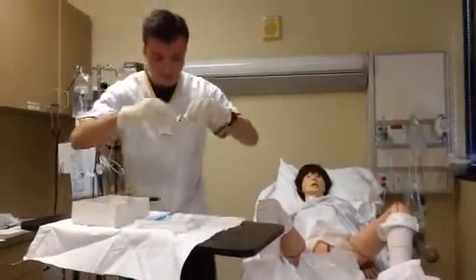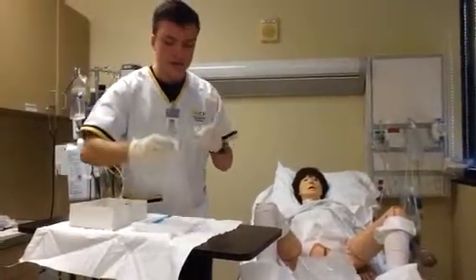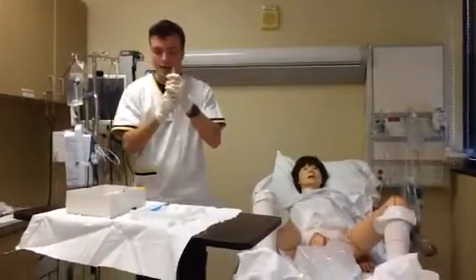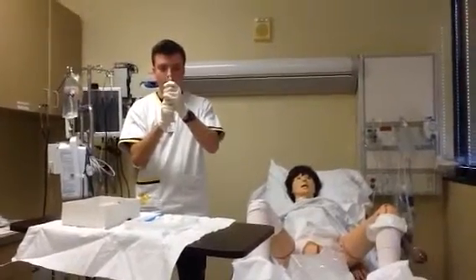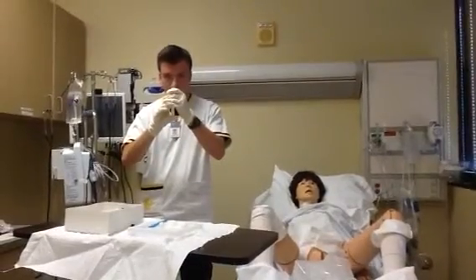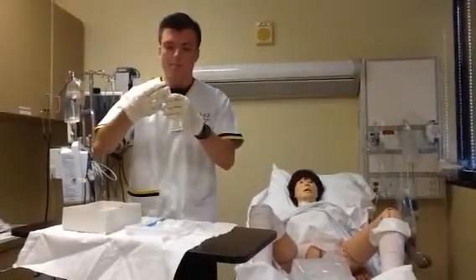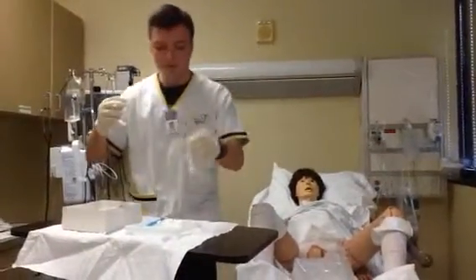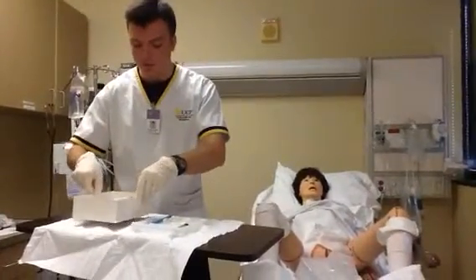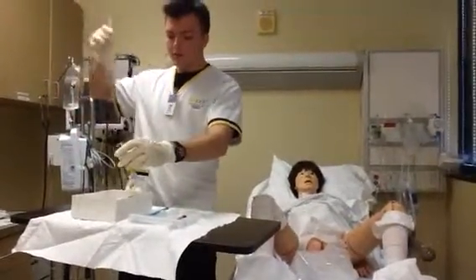Okay. Keeping my hands above waist level, I'm going to get rid of that. Going to exercise my plunger, making sure that it is working. And I'm going to take a step back again to make sure that I do not get any of this water should it shoot out on my sterile field. Okay, plunger is good. Again, making sure at all times that my body faces my sterile field and that I'm working within the 1-inch borders since I am sterile. Get rid of this.